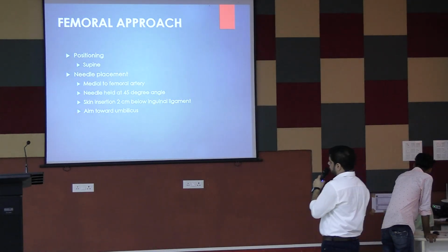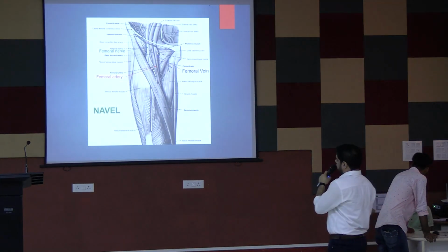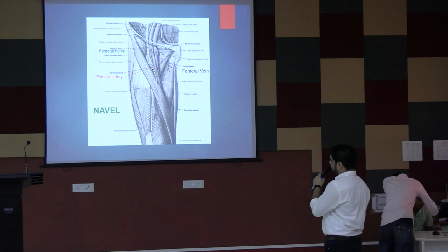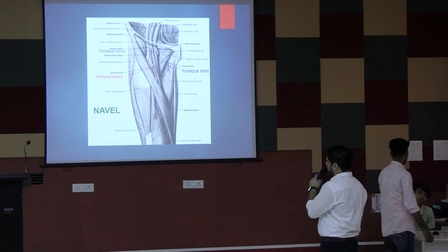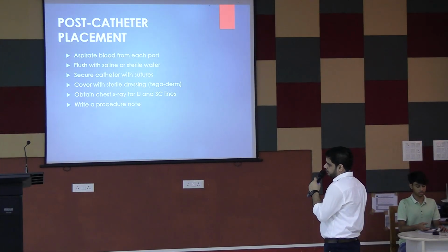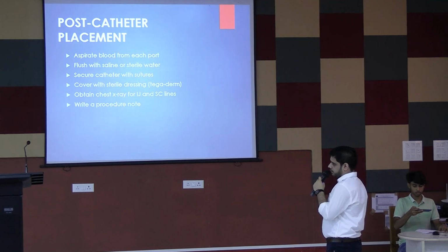Femoral approach. Here is the femoral approach. The femoral vein is normally placed medial to the femoral artery. The order is vein, then artery, then nerve, so the femoral vein is extreme medial. First, the patient is in supine position and you palpate the femoral artery pulsation. Then you locate the vein. Then needle introduction should be done. If blood comes, the same procedure will be done.